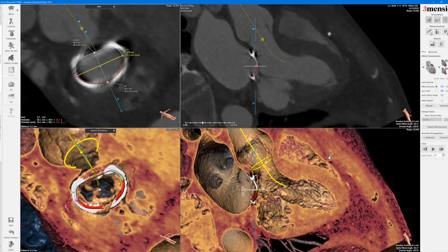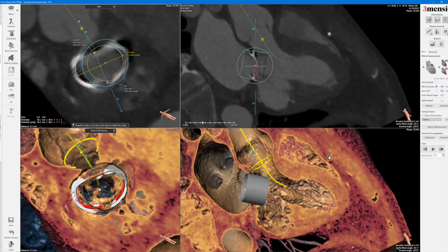This is probably a 28-millimeter annuloplasty ring — you can see the AP dimension is quite small at only 18mm and the area is 430 mm². Depending on whether it's rigid or semi-rigid, the ring might not expand or circularize completely. The smaller the annuloplasty ring, the more rigid it is, so the ability to circularize with a smaller ring is more difficult than with a larger ring. So let's put a virtual valve across — in this case you may end up needing a 26-millimeter S3 valve.